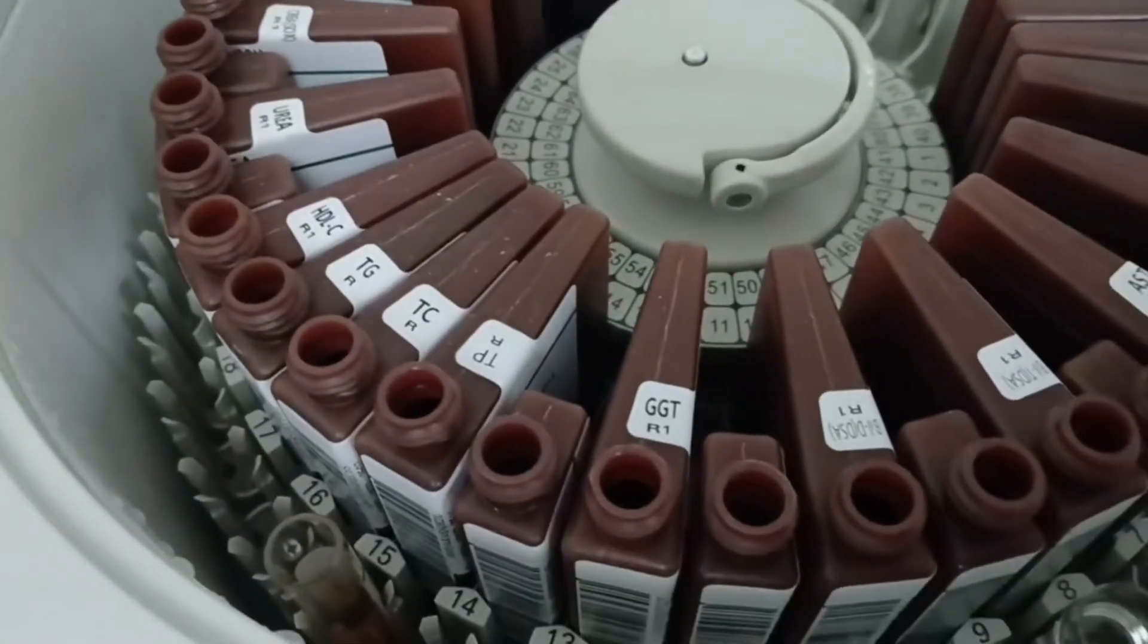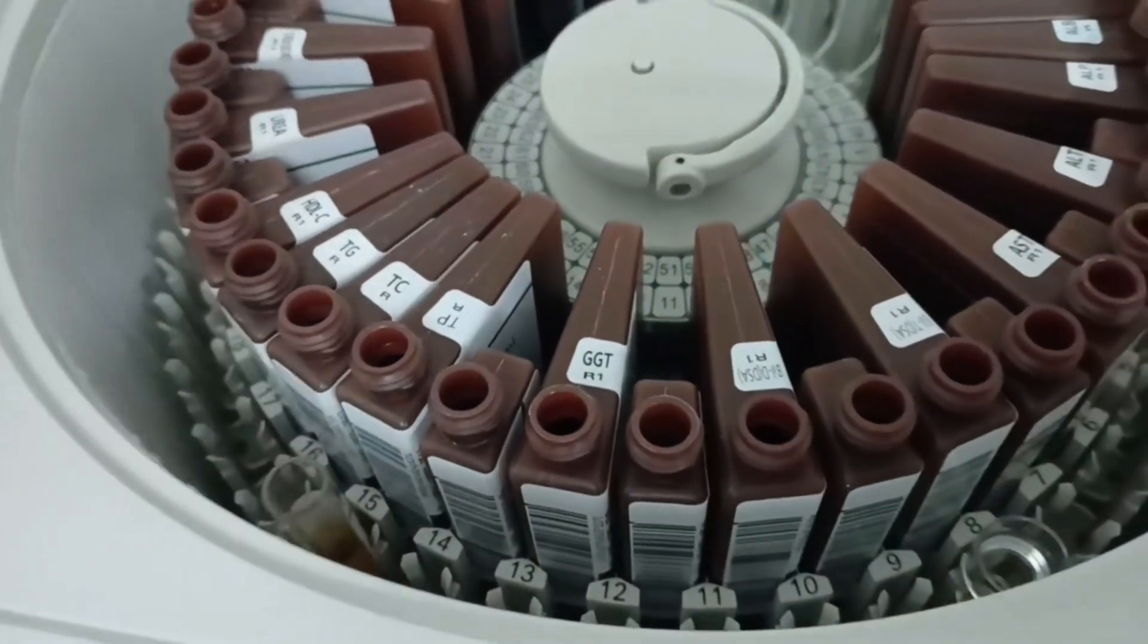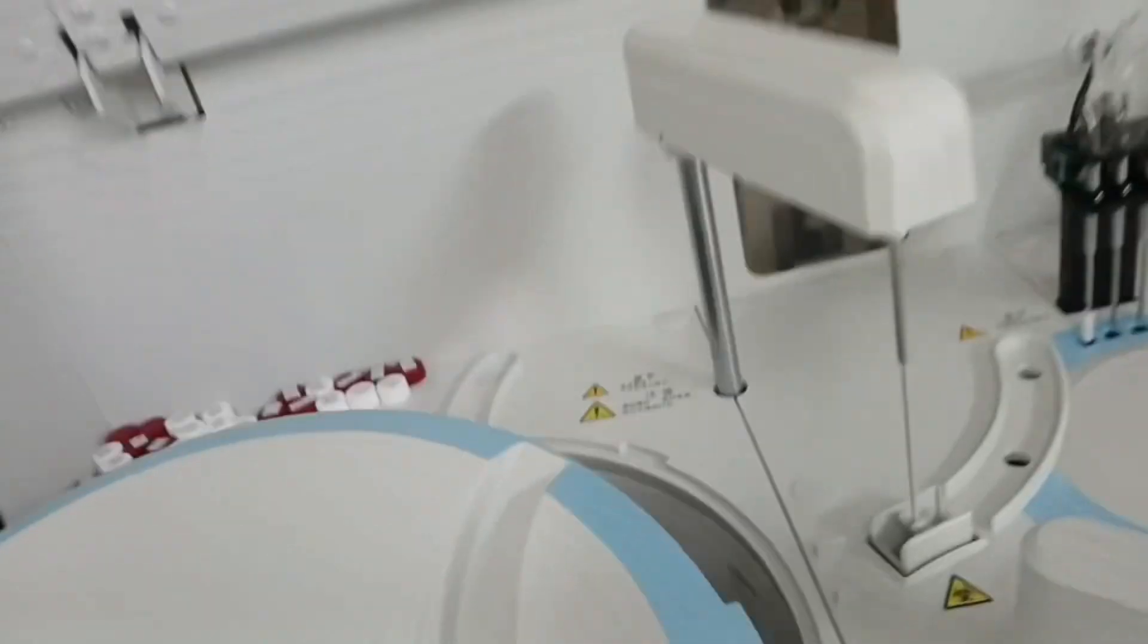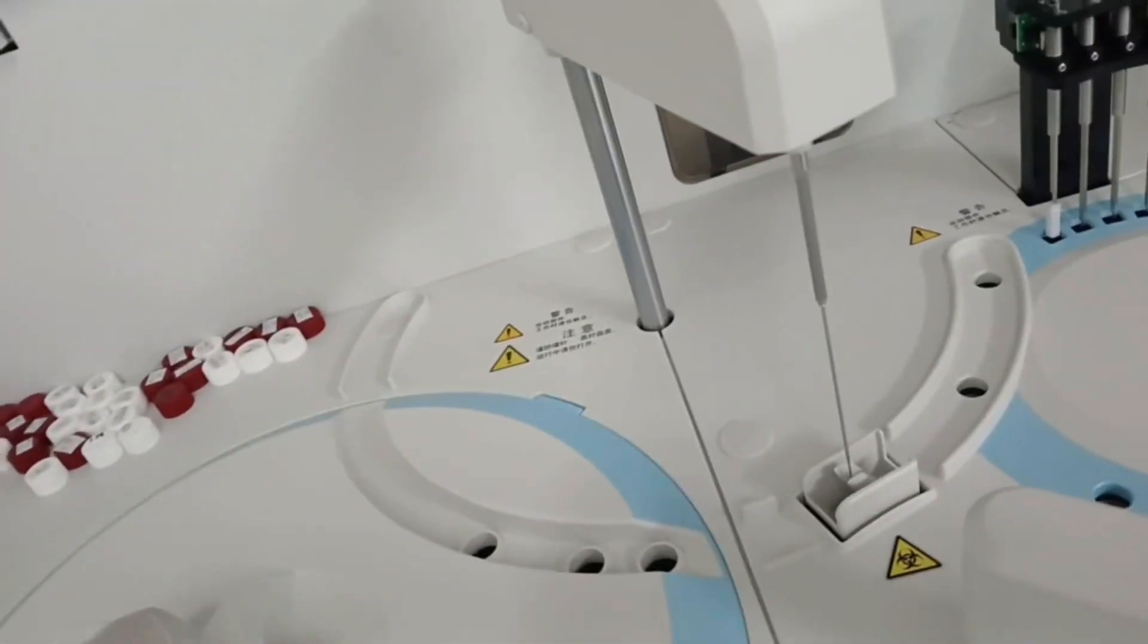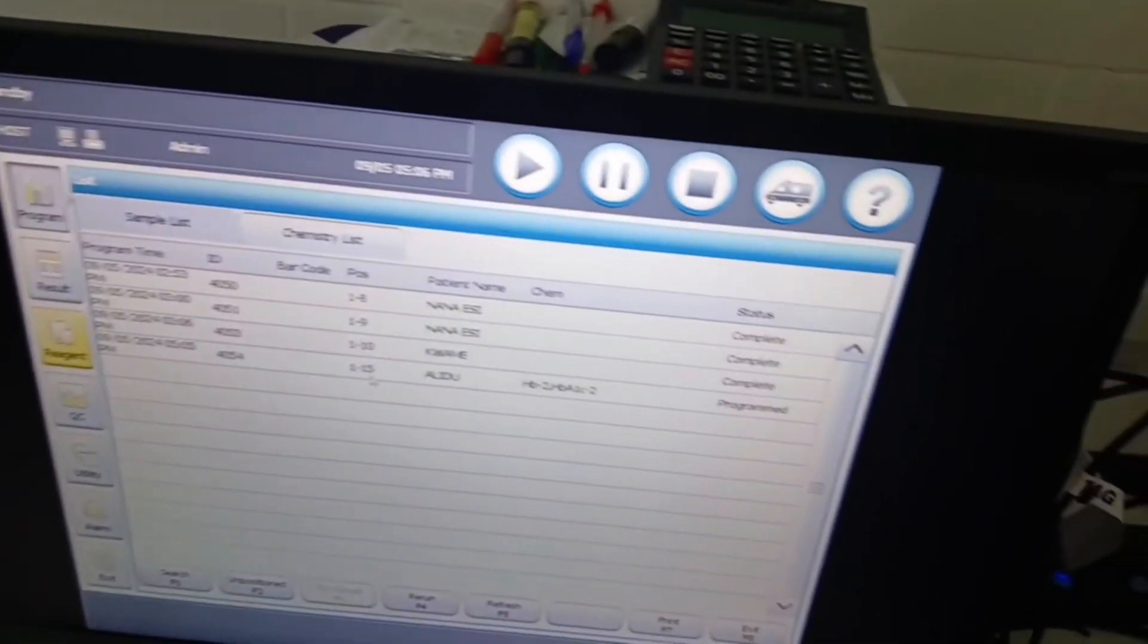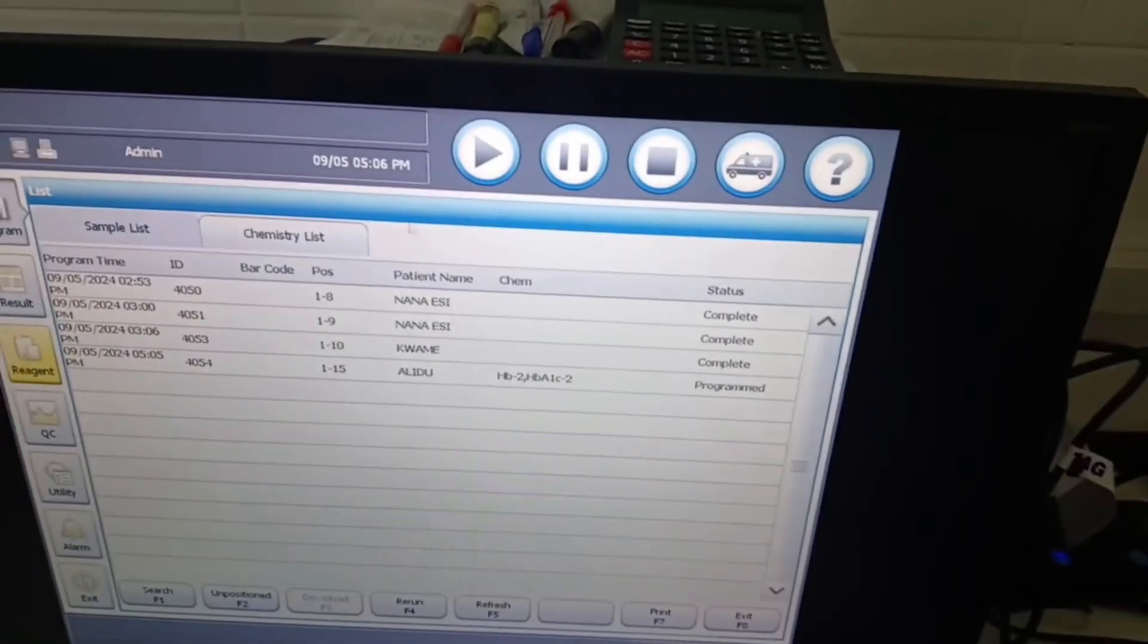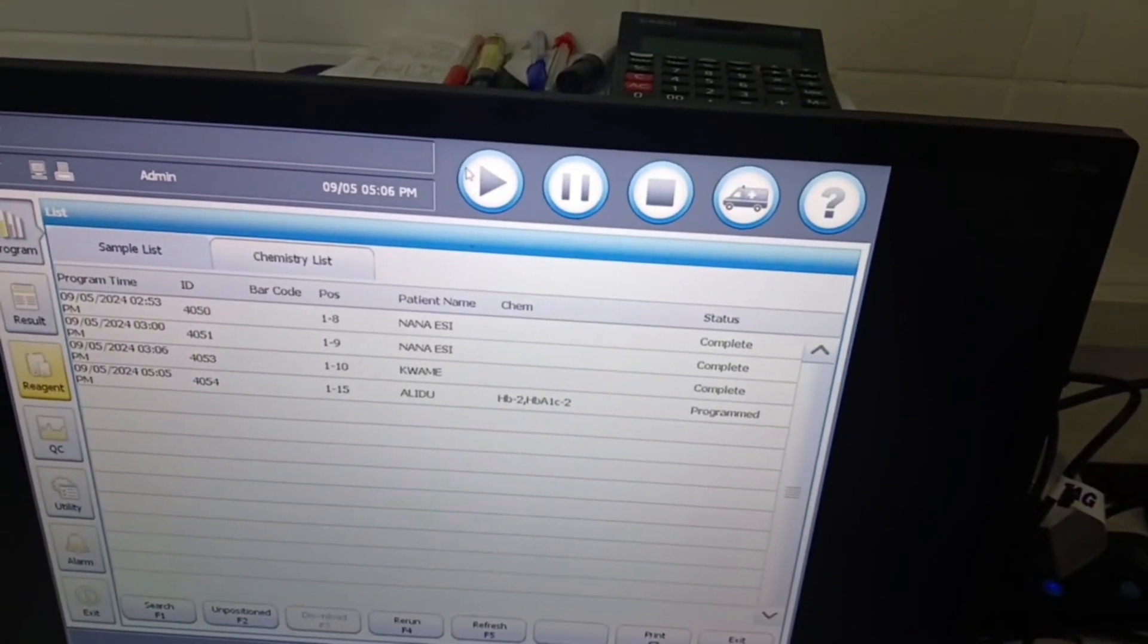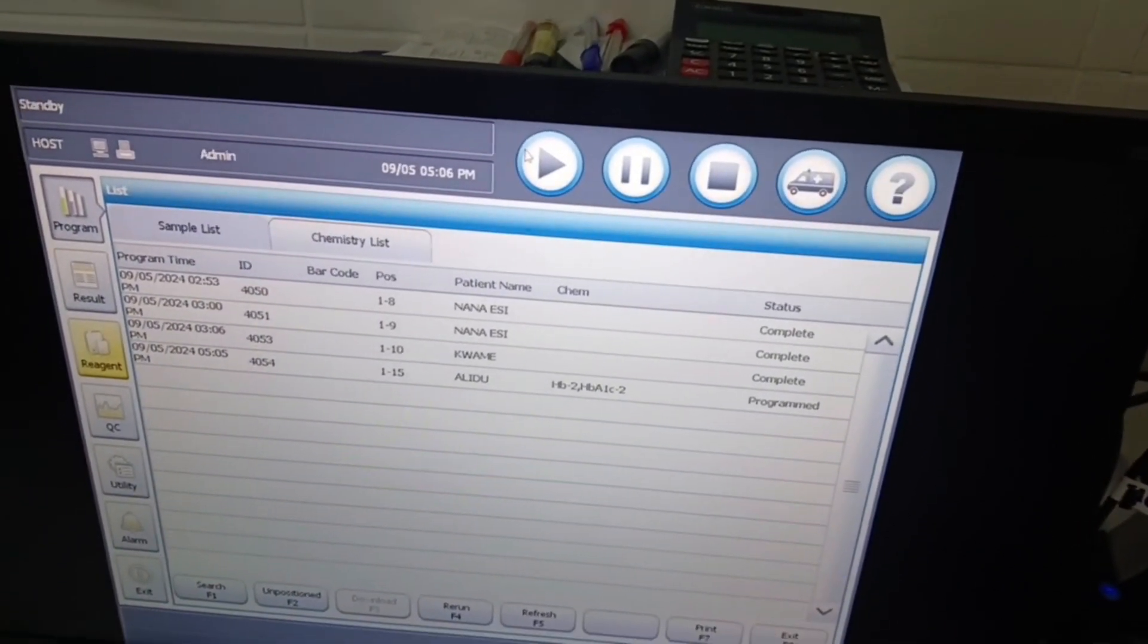Then we properly cover our machine and press play to begin analysis.